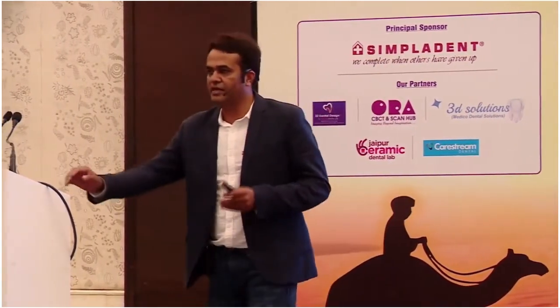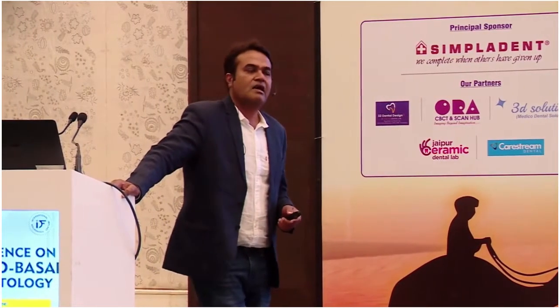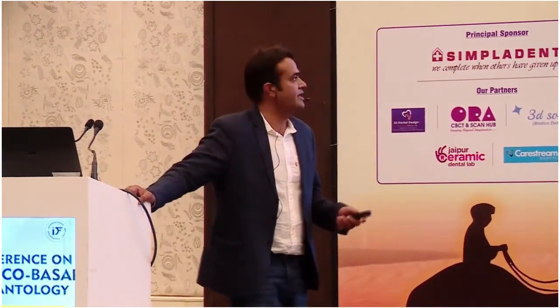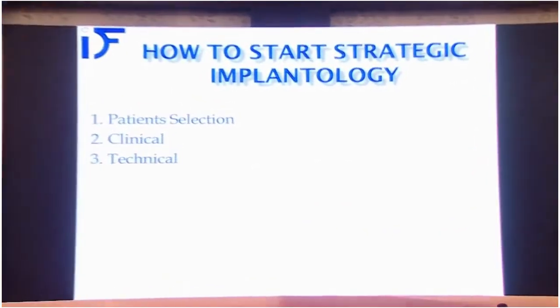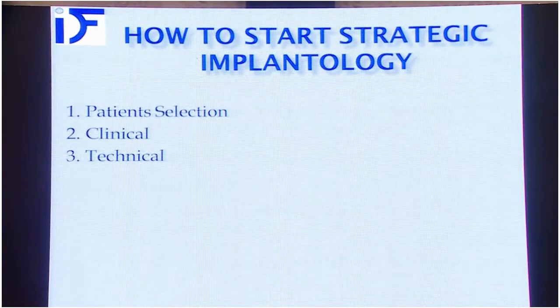Now, for the beginners, there are many doubts and questions about starting with this science, because it requires a little technical skill, but that is required for the controlled insertion of the bicortical screw and the true bicortical anchorage we should get. How to start strategic implantology? Start from the very basics, that is the patient selection, then the clinical scenario, and then the technical issues. I am going to describe each one in detail.